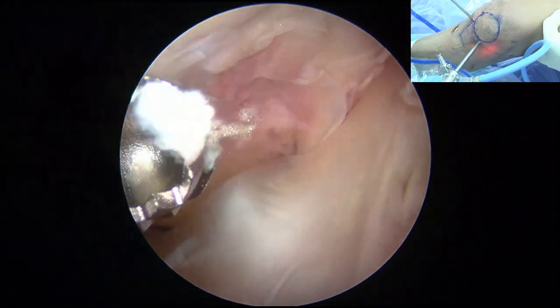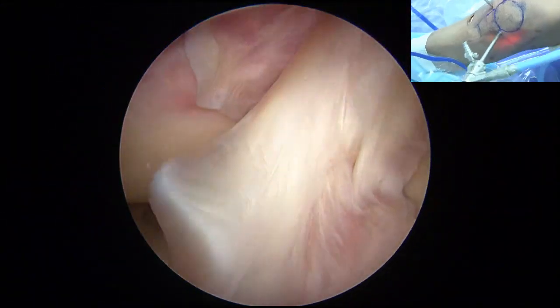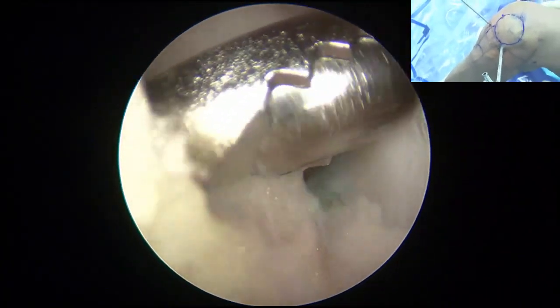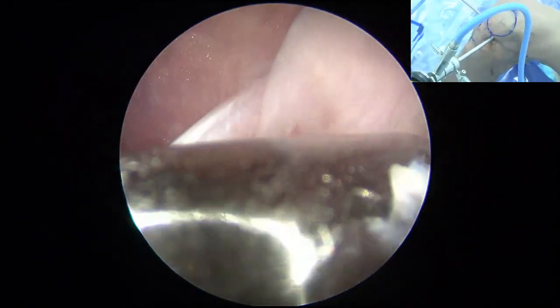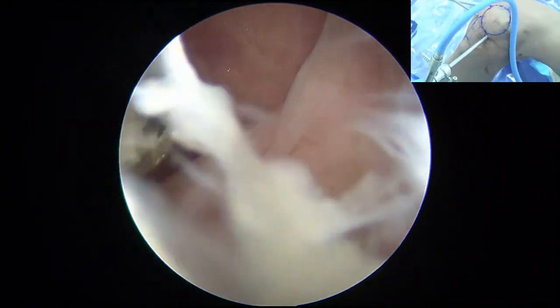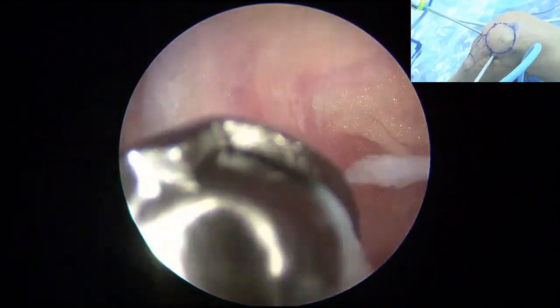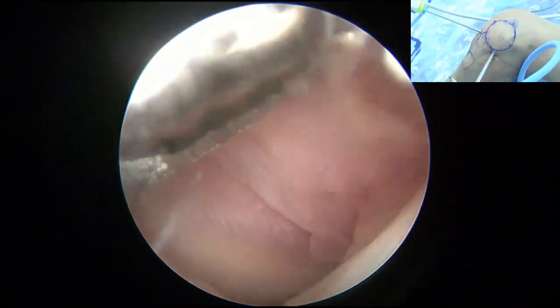Very good. Now you can bend the knee to 90 degrees. Just now it was extended so the instruments could meet. Lean a little bit, now flex the knee, until you see the anterior compartment very well.